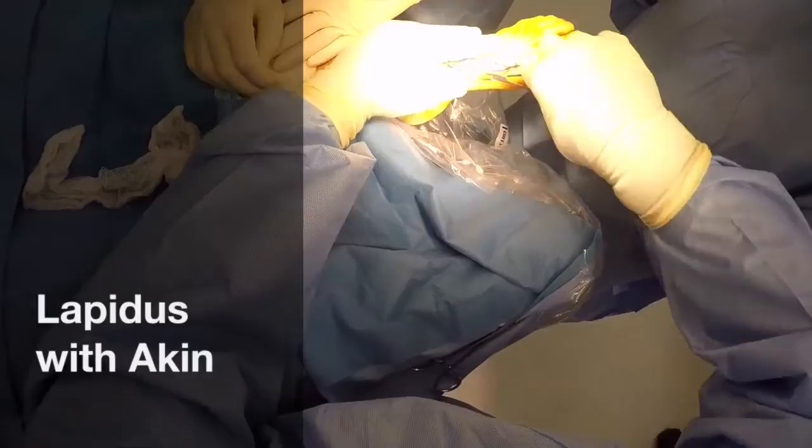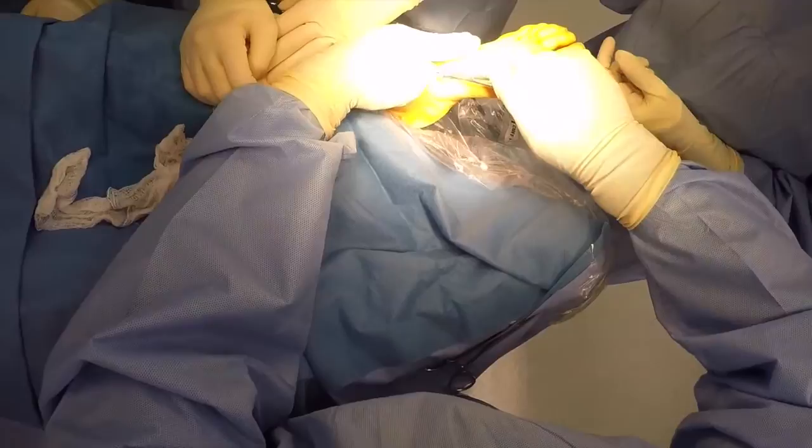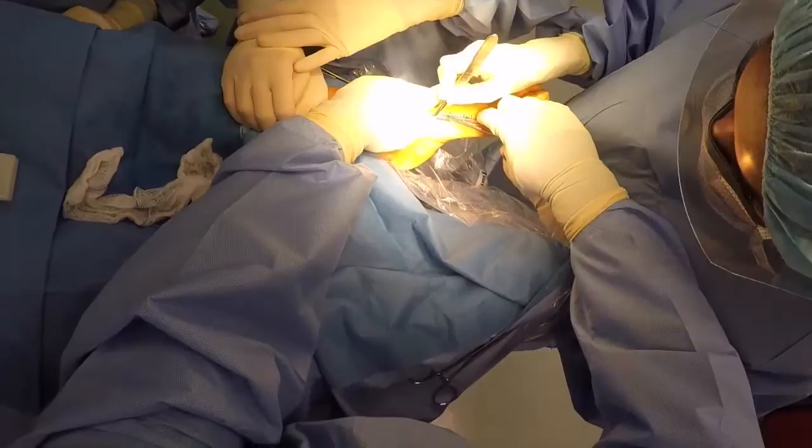Hello, it's Dr. Matthew Andrews. This procedure is a Lapidus procedure with Akin osteotomy for correction of severe hallux valgus deformity and increased intermetatarsal angle. We jump right into the procedure here.